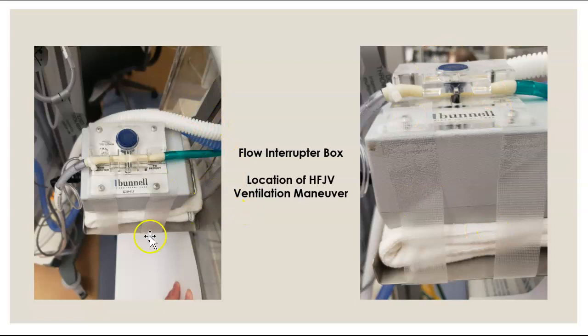I'm fancy, so I have this little shelf I place outside of the isolette. And here is the bed. You can see my circuit from my Draeger, and then my circuit from my jet continues into the isolette to the baby. Some facilities will just put this into the isolette next to the baby for positioning. But if you have the little shelf, which is beautiful, it works lovely, make sure you put either a diaper or a burp cloth so that we don't have that plastic on metal loud, harsh sound for neurodevelopment, so that's quieter for the baby. And then you don't have to tape it. I like to tape it. That's just me and my paranoia of having it get bumped or knocked somehow. It's just another prevention, but then I don't tape over top here so that I can properly manage this circuit.